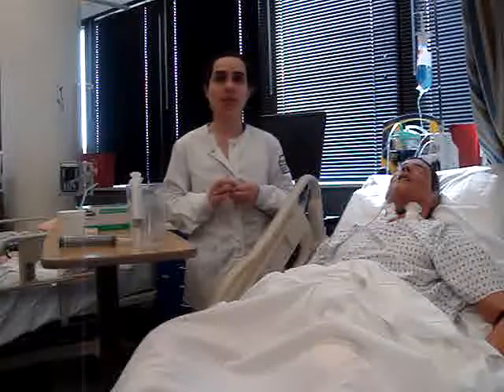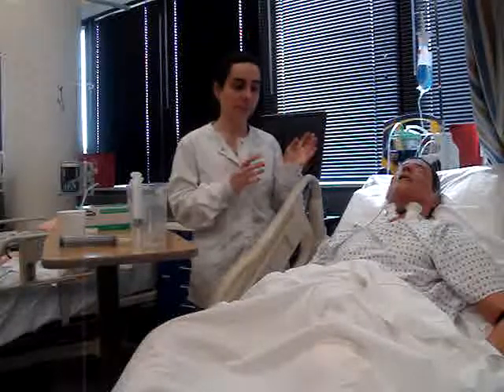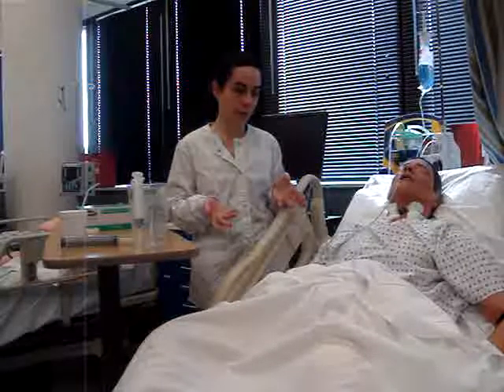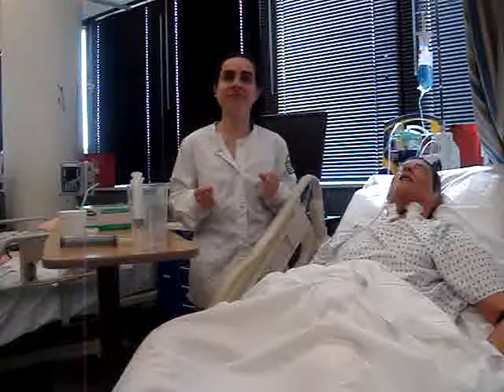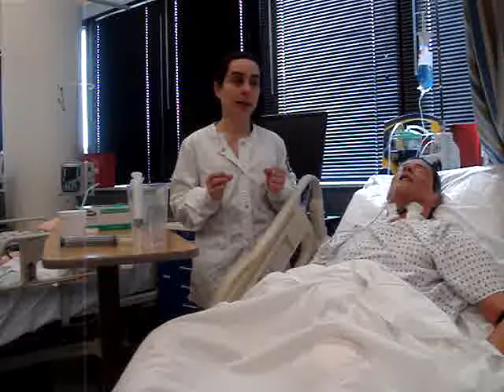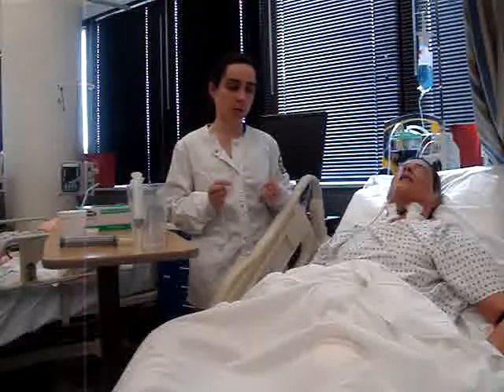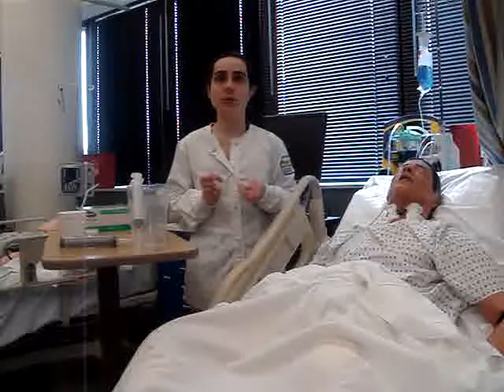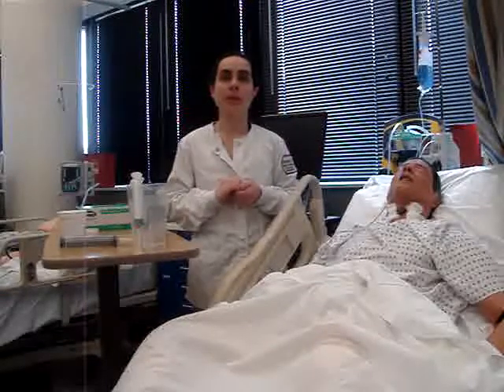For the closed feeding systems, I will pretty much do the same thing, but I'll check the expiration date. I will label the bag and the tubing again. I will spike the container with the compatible tubing, just so I make sure everything's working properly. I'll prime the tubing. I'll connect the tubing to the feeding tube, and I'll connect it through the feeding pump, and I'll set the prescribed rate. And then I will discontinue the feeding setup from the feeding tube, and I will flush the feeding tube with a minimum of 30 milliliters of water. And that will be the feeding today.